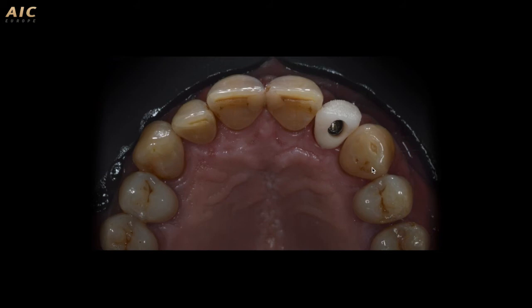This is the occlusal view of the hole of the screw crown.